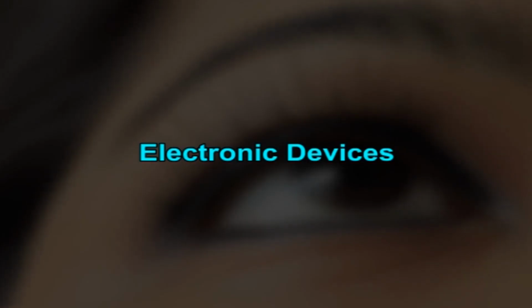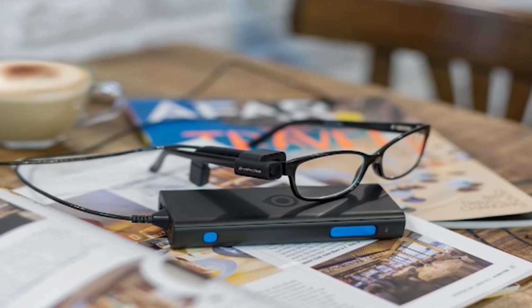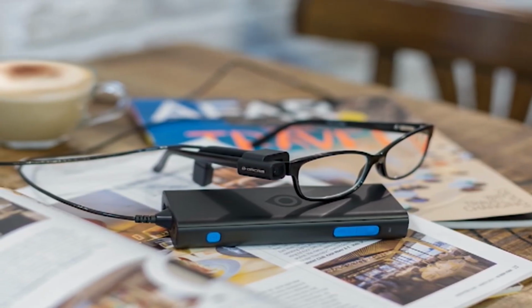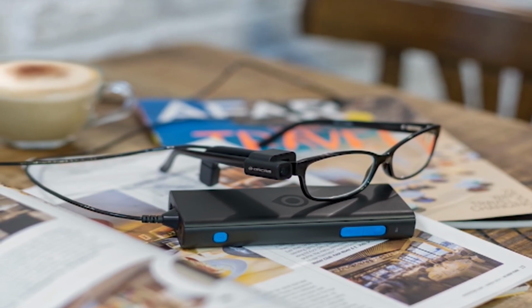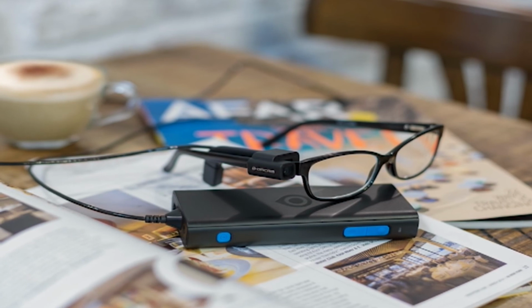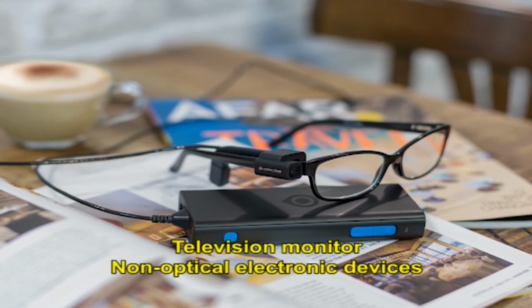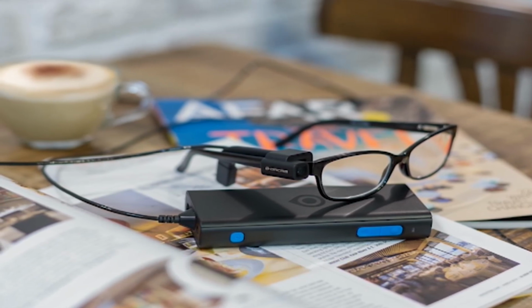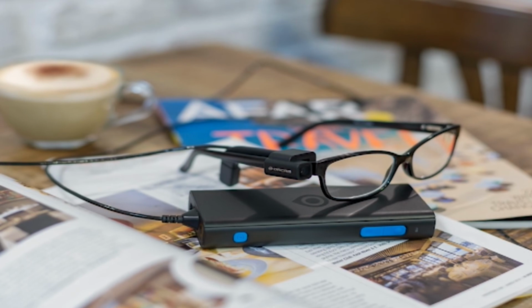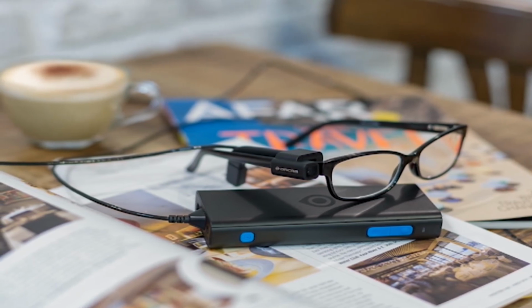Electronic devices. For people with severe visual loss, electronic devices are an option. There are two types: optical electronic devices, which display the task in a magnified form on a television monitor, and non-optical electronic devices, which are conversion systems that convert text into a speech system. Speech system means a computer program that reads text aloud.